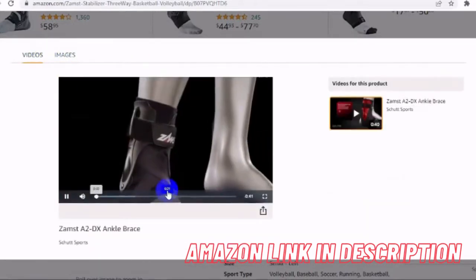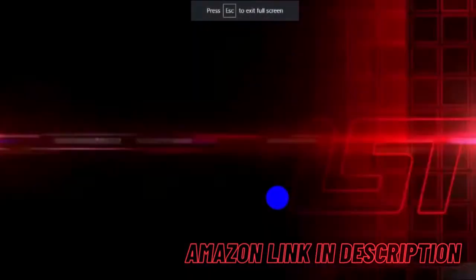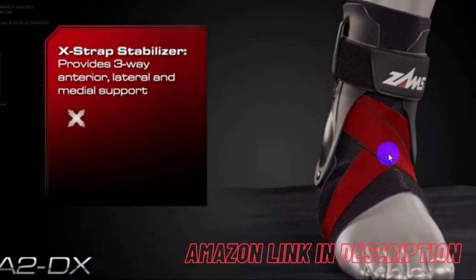Anti-migration: our grip tech ensures strong anti-migration that keeps the ankle from rolling inward and outward. Three-way support: the X-strap design stabilizer provides three-way anterior, lateral and medial support for comfortable professional protection.